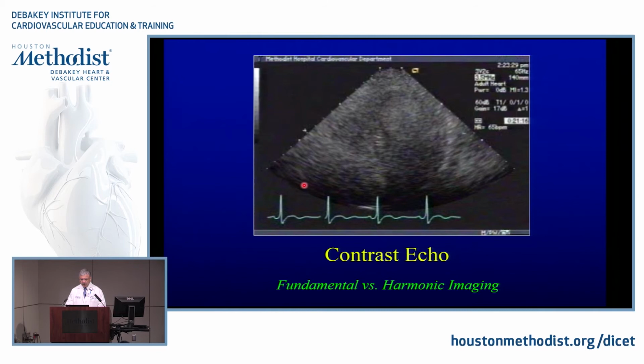This is the same case. All we're changing is imaging from fundamental to harmonic. So continuous, just a flip to harmonic. And let's take a look. The mechanical index is high, but here you go, 3.5 megahertz. If you see an H, it will be harmonic 3.5 megahertz, meaning sending at 1.25 or 1.75, whatever it is, and imaging at 3.5, okay? And let's see what it looks like. First, I won't bias you, you'll see it with your eyes.